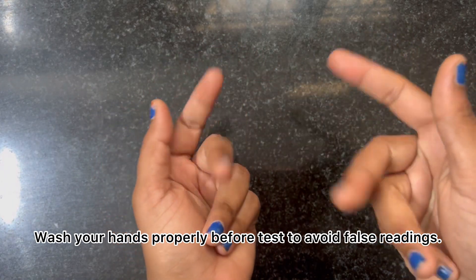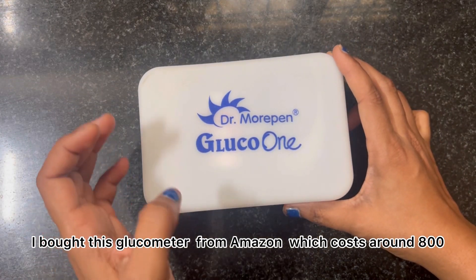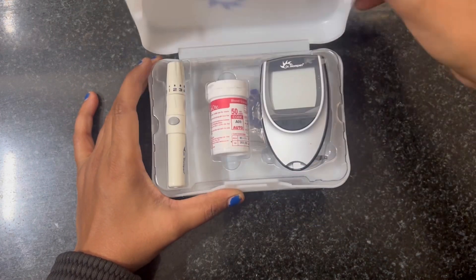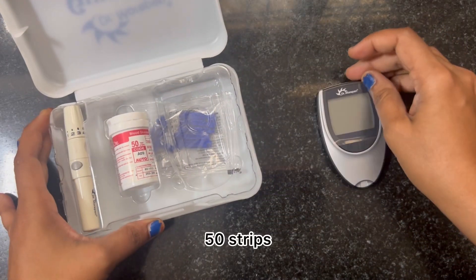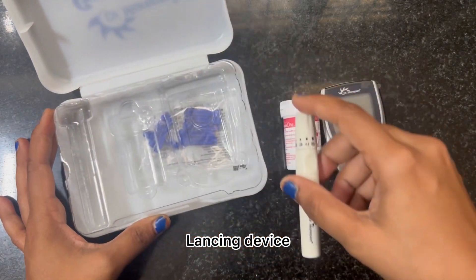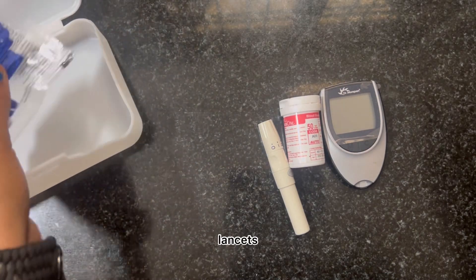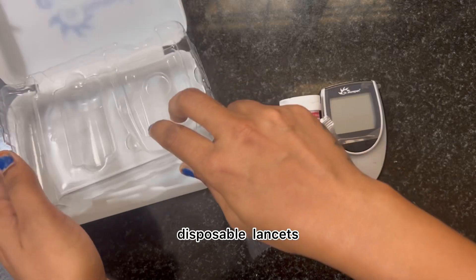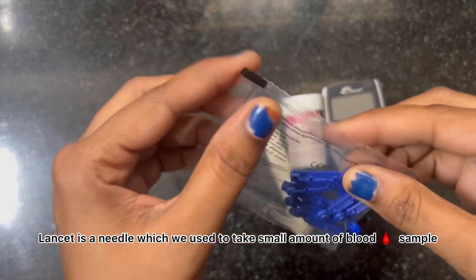I bought this glucometer from Amazon, which costs around 800 rupees. It is a combo pack which contains a glucometer, 50 strips, a lancing device, and lancets. The lancet is a disposable needle which we use to take a small amount of blood sample.